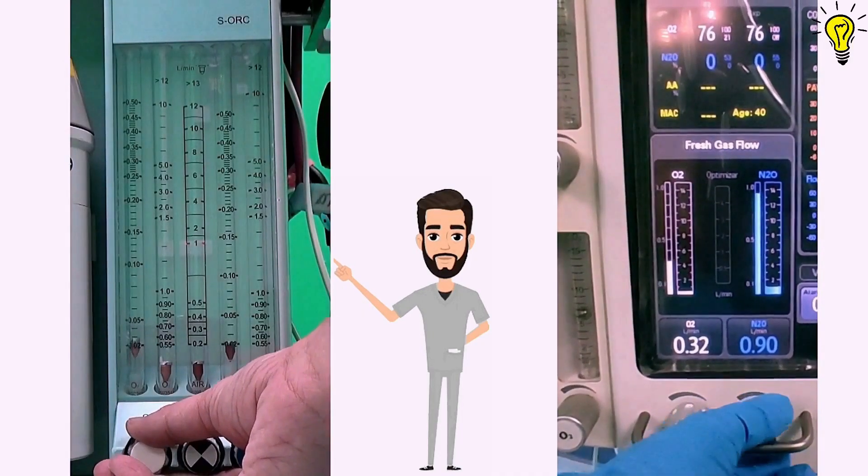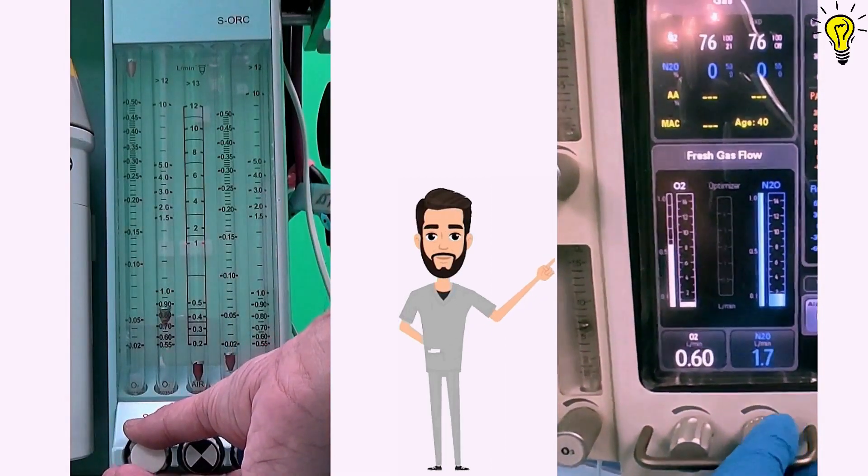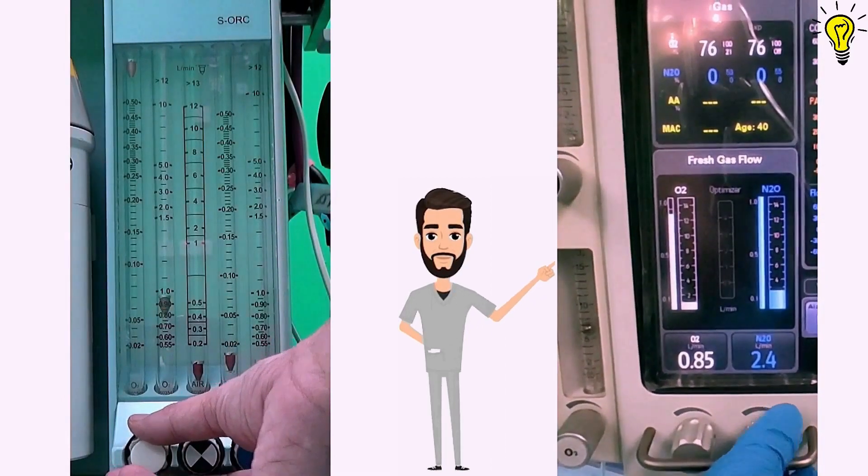On the left side you can see the mechanically pneumatically powered flow meter. On the right side is the electronic digital flow meter, more common in newer machines.